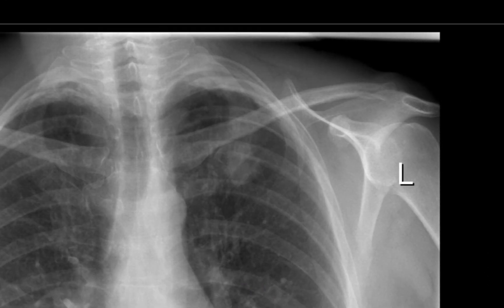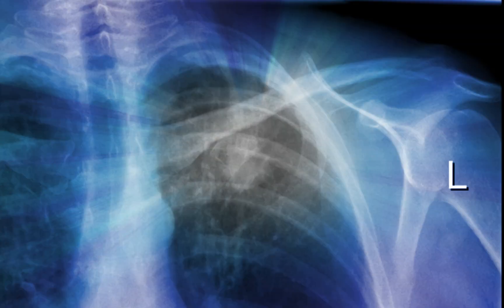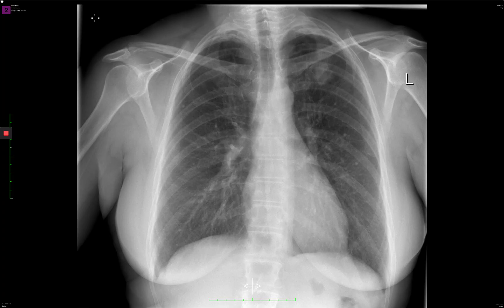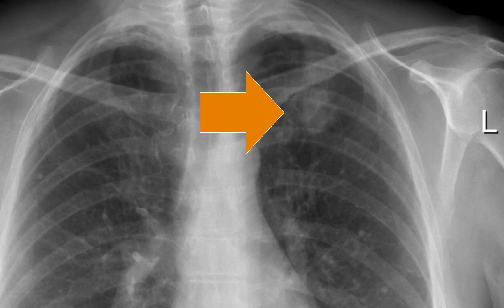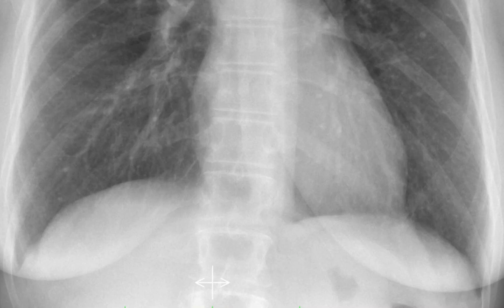This is the frontal chest radiograph demonstrating a left upper zone oval irregular speculated lesion projected over the left first rib, measuring approximately 3 by 2.5 centimeters, with no cavitation or calcification seen within it. There are no other satellite lesions or any other lesion in the right or left lung seen.